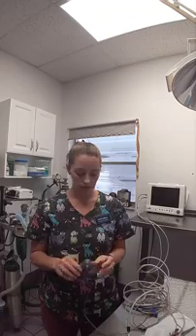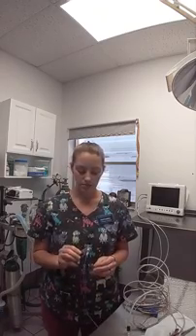I'm going to be demonstrating and talking a little bit about our monitoring devices that we use for anesthetized patients. One of them is the pulse oximeter. It measures the oxygen saturation of the hemoglobin. So it calculates the difference between the oxygenated and deoxygenated hemoglobin based on the absorption of the light.